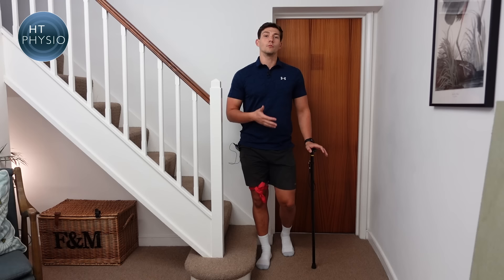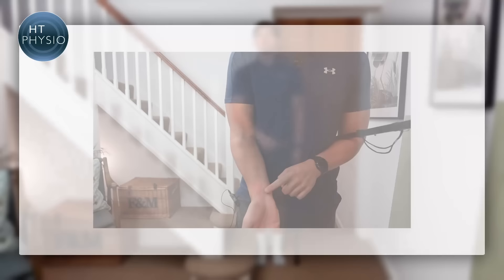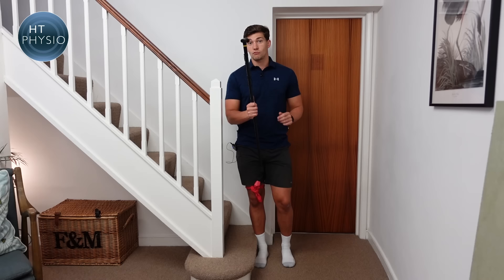Before we show you how to use a stick on stairs, we need to make sure it's the correct height. When you're standing up straight, the handle of the walking stick should line up with the first wrist crease on your wrist when you let your arm hang down. This stick has been measured up correctly for me — it probably looks a bit low to many people, but this is actually the correct height to use a stick most safely.